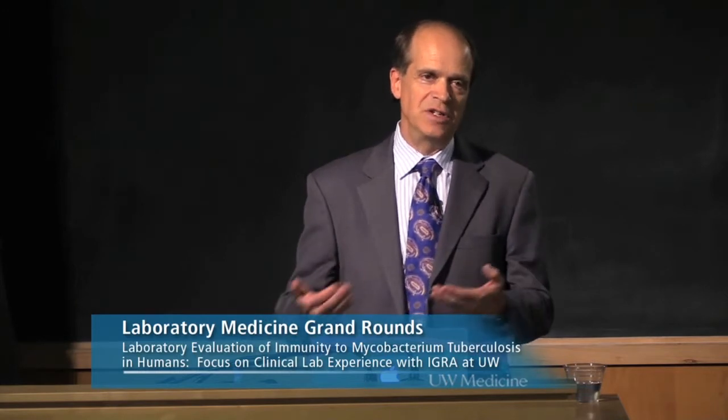So I know that ICE, the Border and Immigration Control people, are starting to use QuantiFERON instead of the skin test now, because it's still sort of mandated that when people come into the country, they should have an evaluation for latent TB, and if it's positive, they should get a chest X-ray and a history and so forth. And I don't think that we have those people's personal health in mind. I think it's sort of that quarantine public health mindset that's going into that viewpoint.